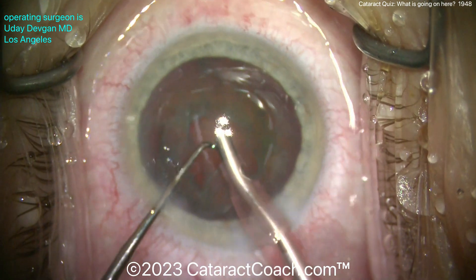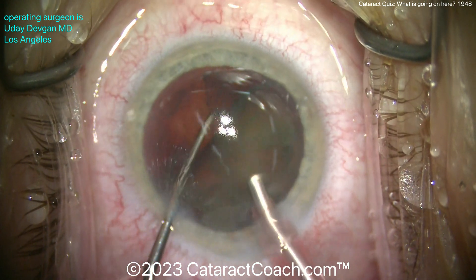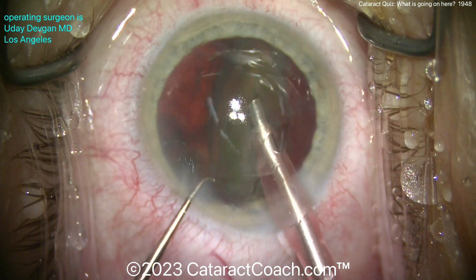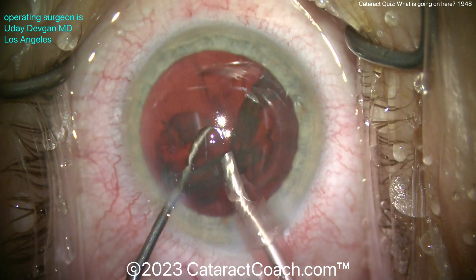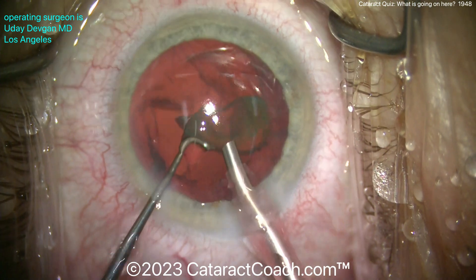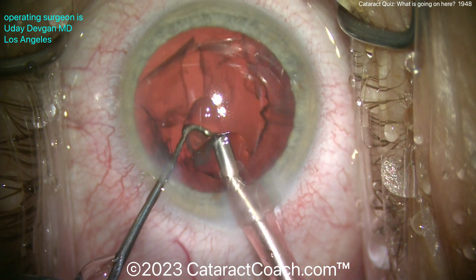Rotating that epinuclear shell and using the vacuum to draw it out of the bag. Once we draw it out of the bag, let's get that chopper behind it — there we go — and we can just tilt this thing up. We need a little squirt of water on the cornea. At this point my technician's already loading up the lens, doing a fantastic job — I'm lucky to have an A-plus team. There's the last piece coming out — looks pretty good, everything looks good.